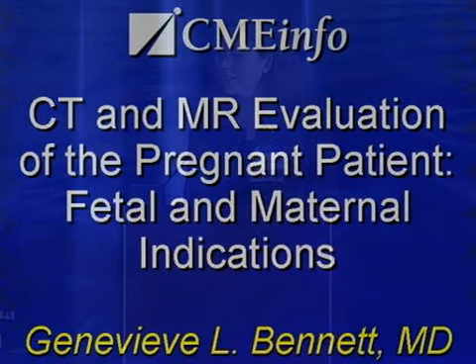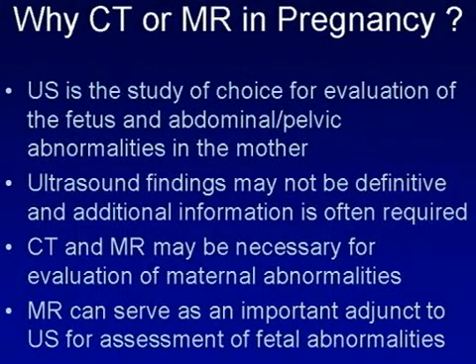Lecture today is entitled CT and MR Evaluation of the Pregnant Patient, Maternal and Fetal Indications. So we're shifting gears a little bit from ultrasound, but why CT or MR in pregnancy? Well, I think we all agree that ultrasound is the study of choice for evaluation of the fetus and for abdominal and pelvic abnormalities in the mother.